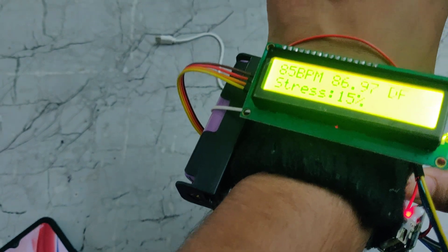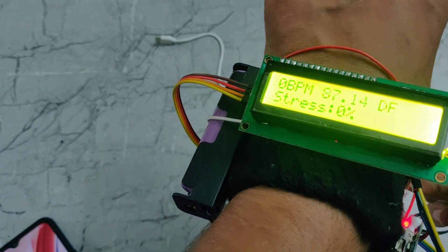Let me place our finger on the sensor. We can see it is now showing the sensor values.